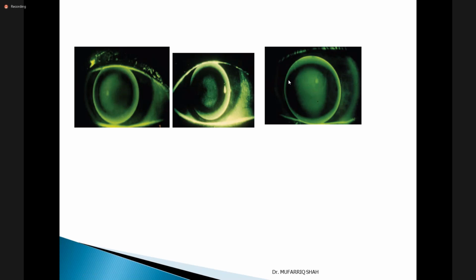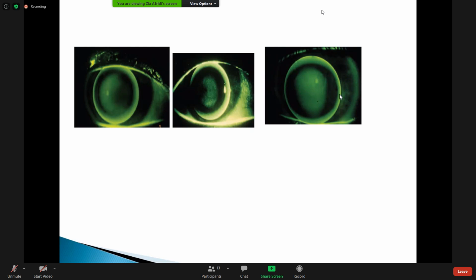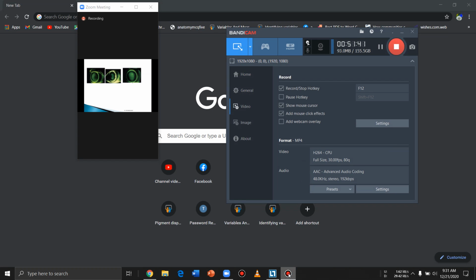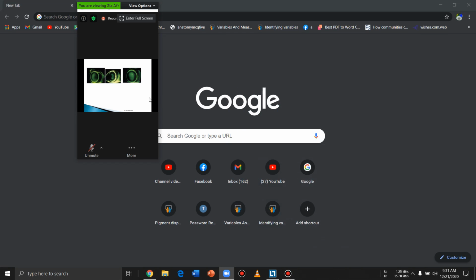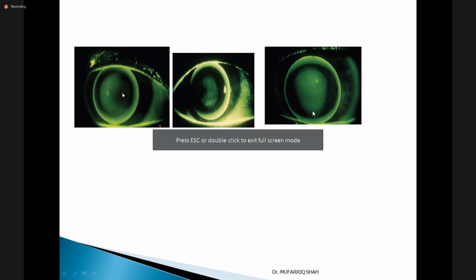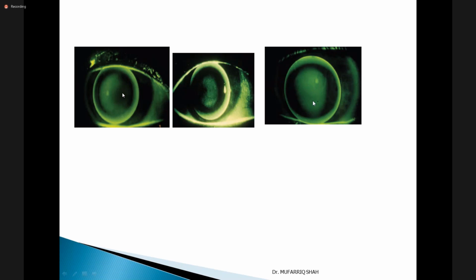Can you see here? Yes, sir. If you see the periphery here at 3 o'clock and 9 o'clock, it is optimum. So you will say, okay, at 12 o'clock and at 6 o'clock, the edge lift is a bit greater, so I can apply asymmetrical peripheral toric technology, but you cannot apply the peripheral toric technology because the central pooling is much greater.